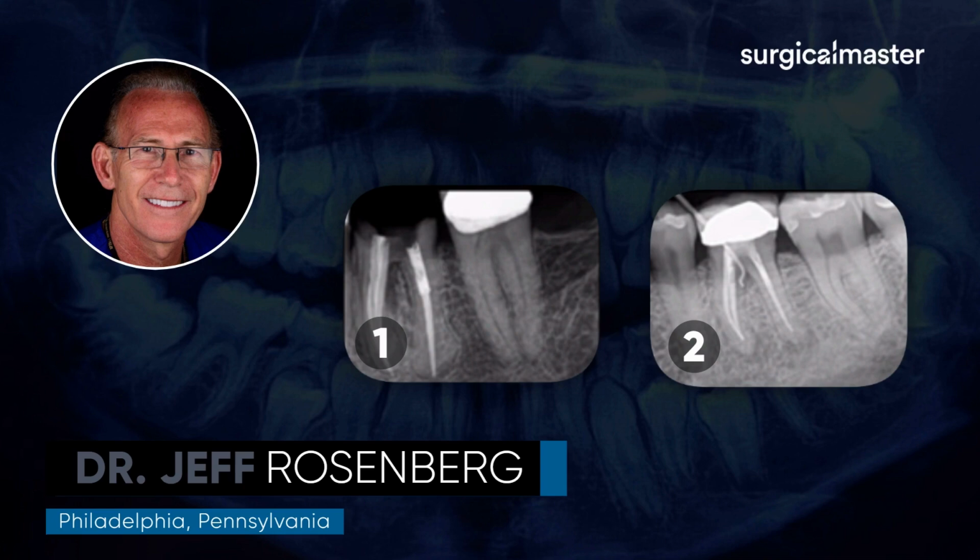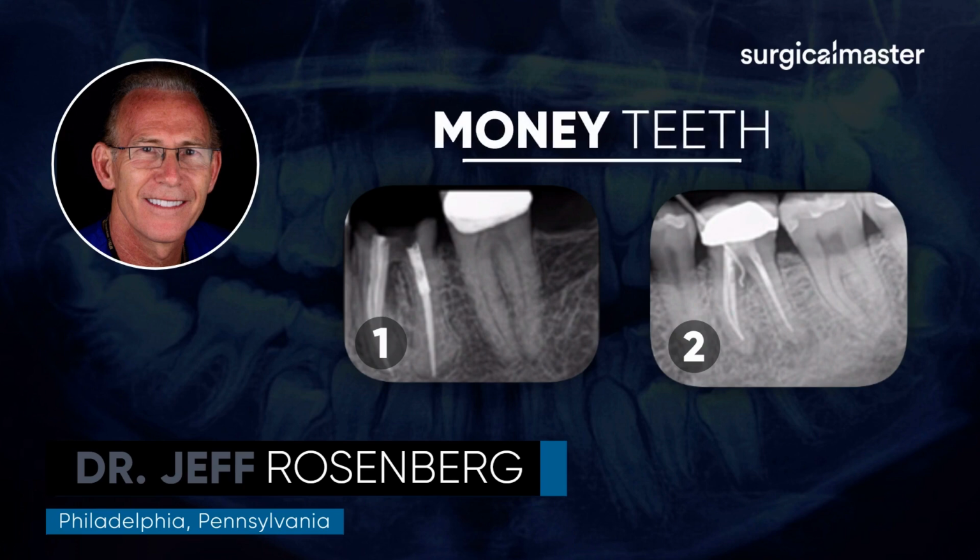Jeff sent me two x-rays of two money teeth. And if you're not sure what's a money tooth, go and read the book. It'll explain everything in detail, including all the extraction protocols. We're basically referring to the lower first molar. And Jeff sent me two radiographs with two teeth that he's planning to extract.